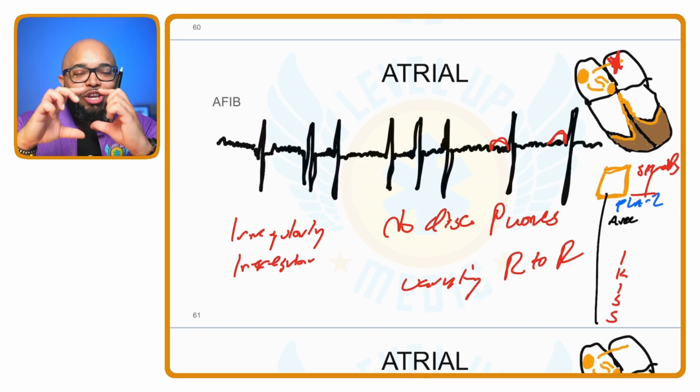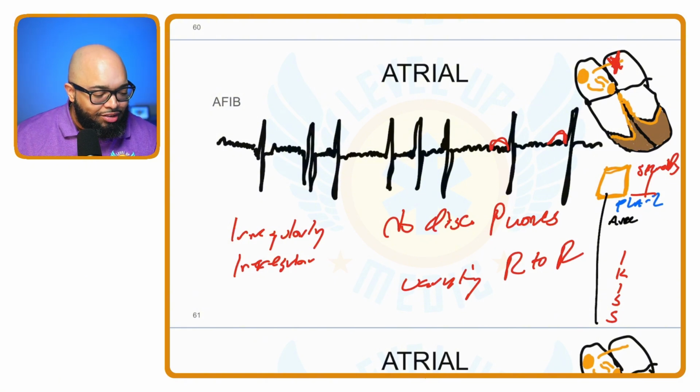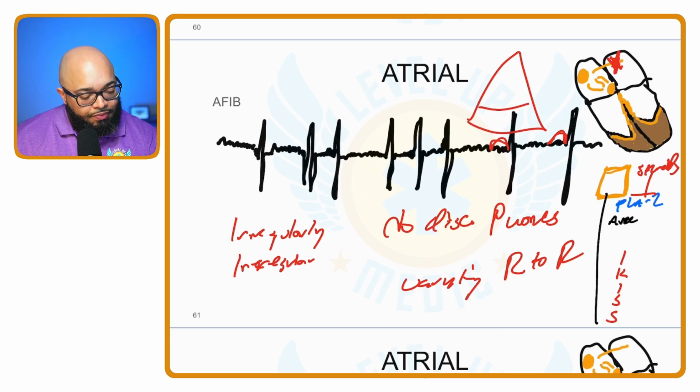There again, guys, when you know more about the basics, you'll be able to know more about everything. So I don't want you to just memorize rhythms. I want you to really understand. Remember how I did on day one? You've seen me do this several times. I talked about the levels of learning. And I said level 1 is where you know what something is. So for instance, this level 1 knowledge would say, okay, this is called a-fib.